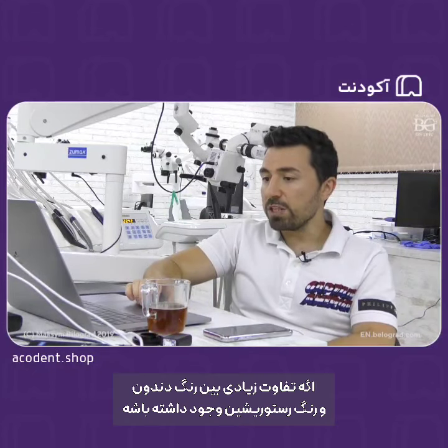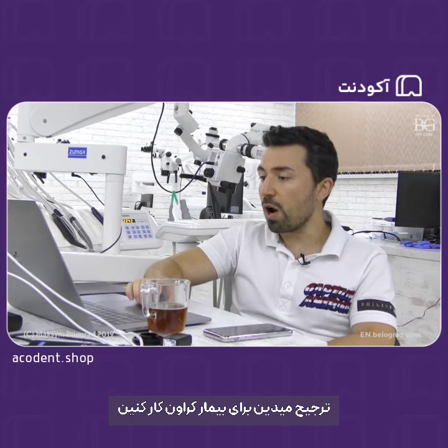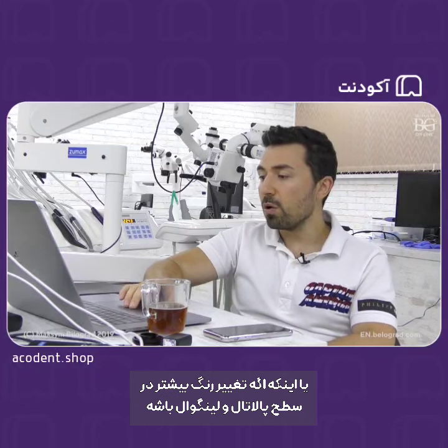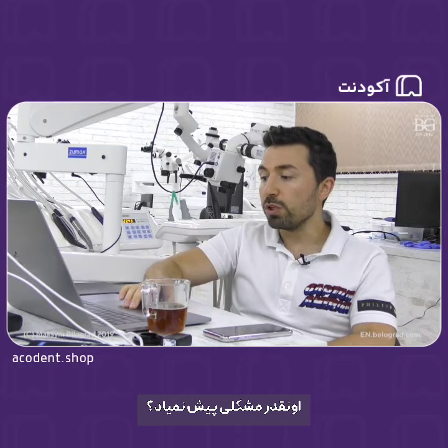Sebastian, if there is a big difference of tooth color compared to restoration color, do you prefer to do crowns for the patient? I mean, in the case of full mouth rehab. Or is a big color difference between tooth and restoration on the lingual palatal side of the tooth usually no problem for your patient?